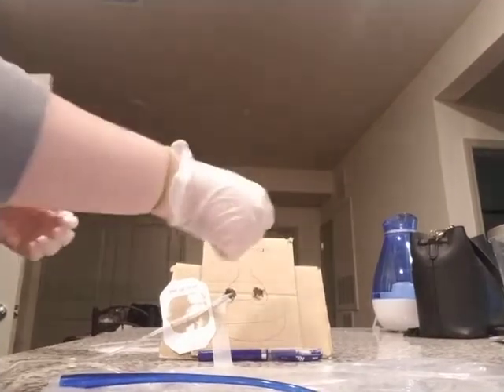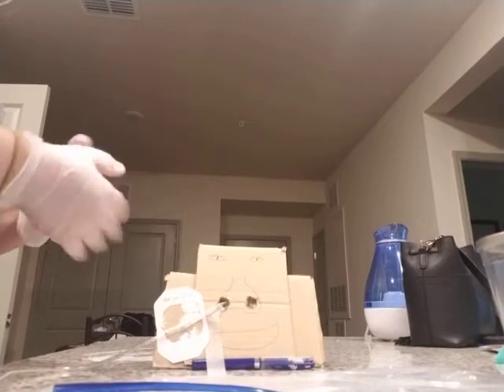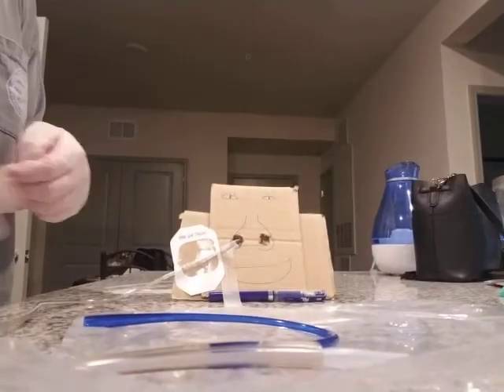And I would clean the naris that I inserted that tube into, and then I would also perform oral hygiene, and I would re-perform oral hygiene every 2 to 3 hours.